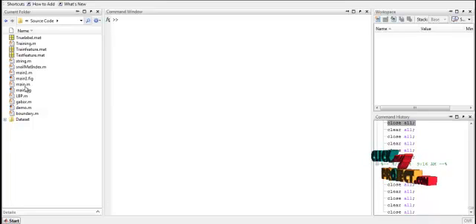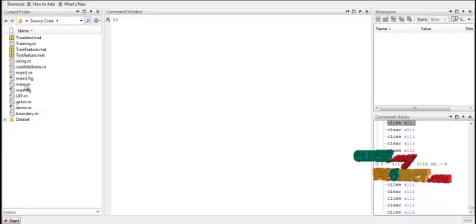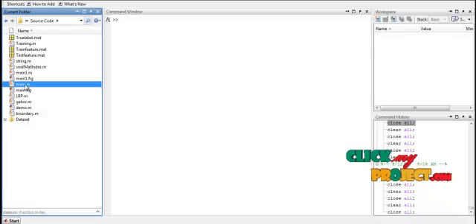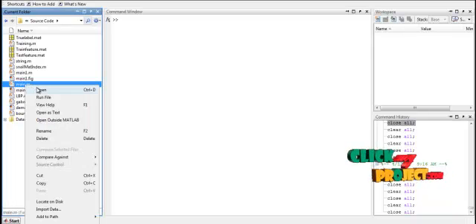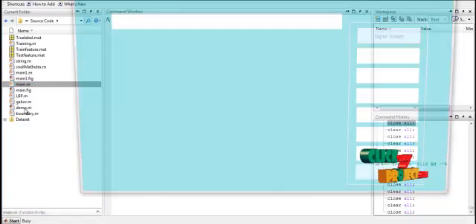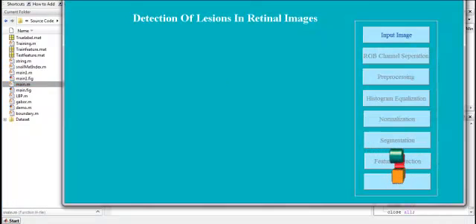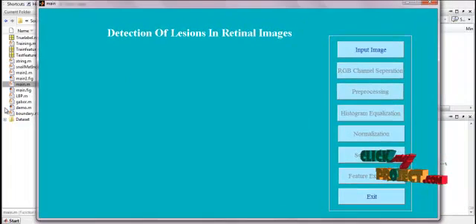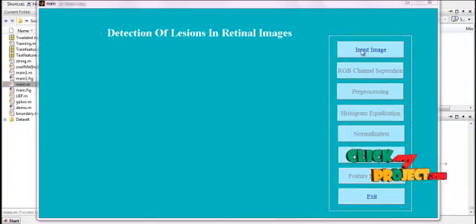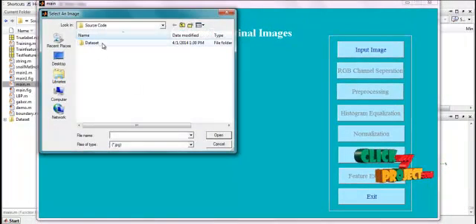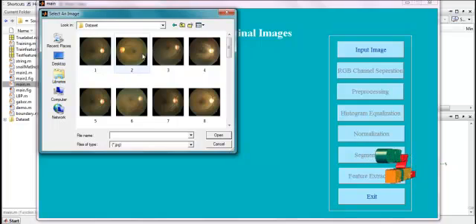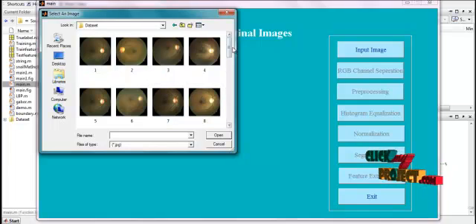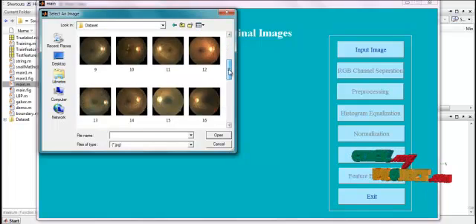To run the program, select the file main.m which is in the source folder. Right-click it and click on Run File. You will get the GUI window required to run the program. Then select any one of the input images from the dataset.